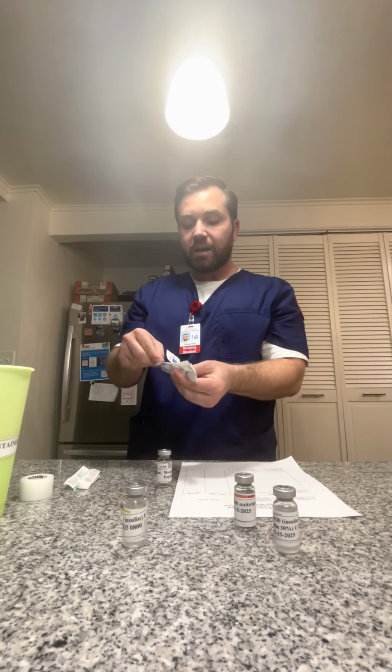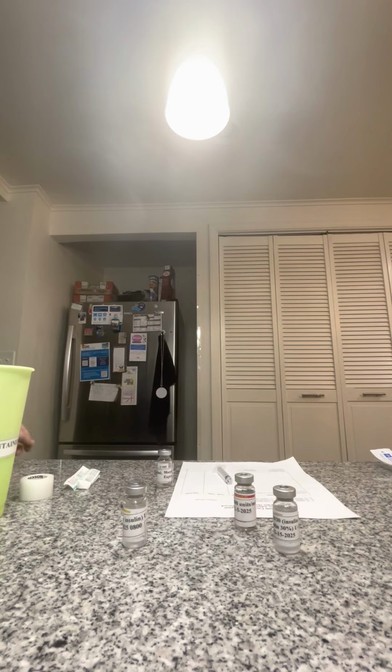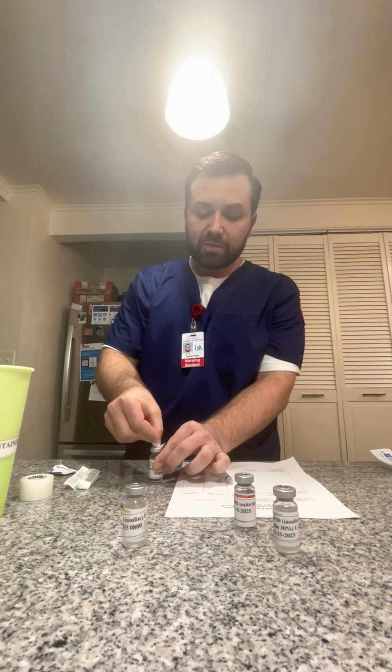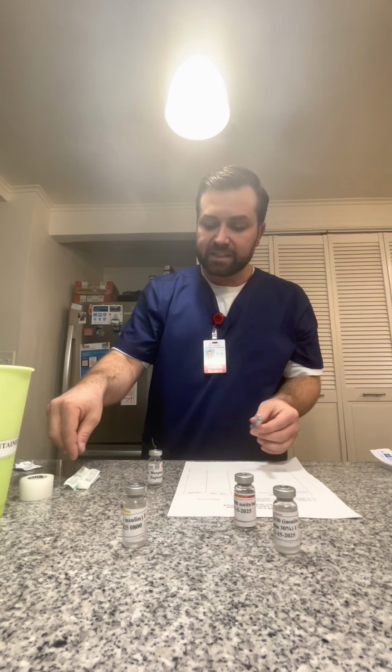And now I will be preparing the medication. I am going to get my syringe out, and I will be applying my blunt tip cannula, but first I need an alcohol wipe, which is right here. I'm going to clean the vial in a top circular motion. All right, perfect. And then I will apply the blunt tip cannula. That can go in the trash. And I will be pulling back 0.5 milliliters of air per the dose.